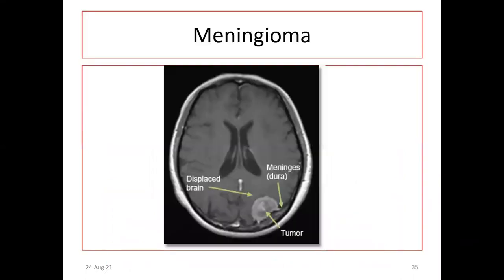If you see a meningioma, it is an extra-axial tumor, highly enhancing or brilliantly enhancing mass lesion, usually dural-based. This is the meningioma, this is the dura, and this is the displaced brain — it is mostly an extra-axial tumor.